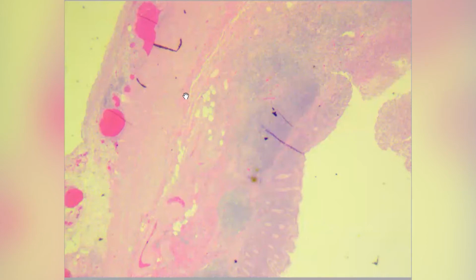If you found these neutrophils, then we can say that this is acute appendicitis. We will see this at high power, but before going to high power, this is the muscularis propria we will search for, and this is the serosa, and it seems like the serosa is infiltrated also with inflammatory cells. And this is the lumen, and it seems that it has also neutrophils and inflammatory cells. So from the low power, we can say that this is acute appendicitis. So let's take a look here.